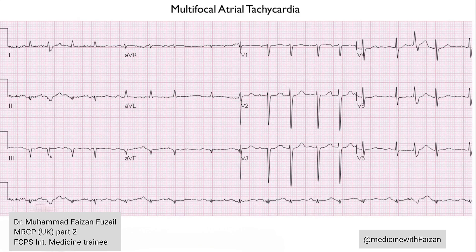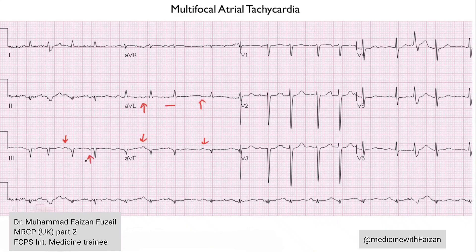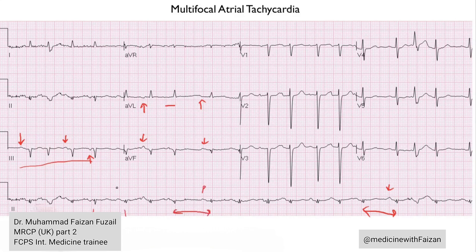Let's look at a real tracing. This arrhythmia does not occur too often. There is some high-frequency artifact you have to ignore. If you look at aVL, some p-waves are inverted, one is flat, and one is clearly upright. In other leads, one p-wave is very tall and another is much flatter. There's a biphasic p-wave here, one inverted, and one upright — so even in lead 3 you have three different p-wave morphologies. The rhythm strip is unclear due to artifact, but there is no fixed p-to-p interval suggesting a regular underlying sinus beat. Maybe a tall p-wave here and there suggests sinus rhythm trying to break through, but the majority of p-waves are coming from different spots in the atrium. This would be an example of MAT.